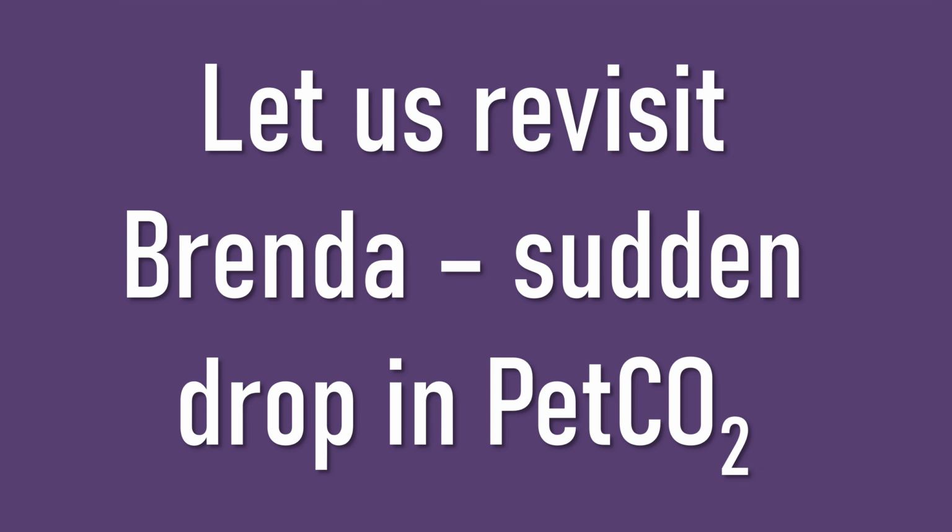This was the lady in her 50s who was having a general anesthetic for a total abdominal hysterectomy, and her end tidal CO2 all along was 40 millimeters of mercury, or 5.1 kilopascals. In the middle of the operation, the end tidal dropped to 20 millimeters of mercury, or 2.6 kilopascals. Well, let's see if we can work out what happened to this woman.